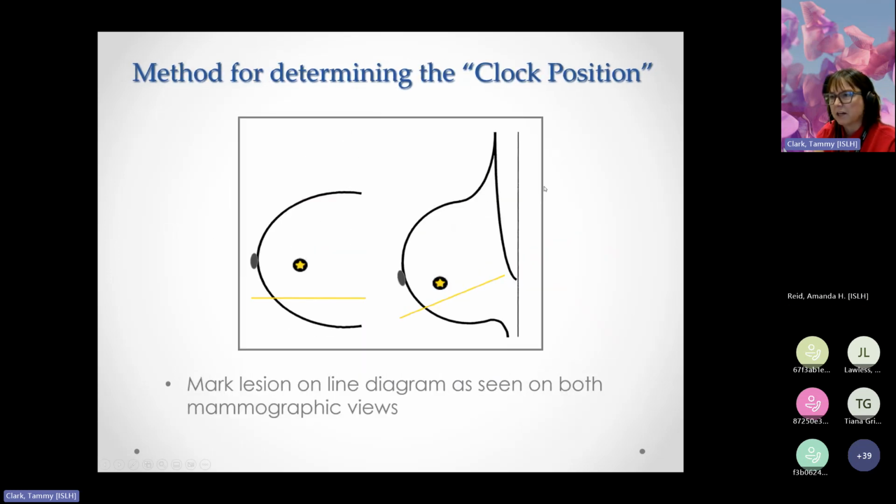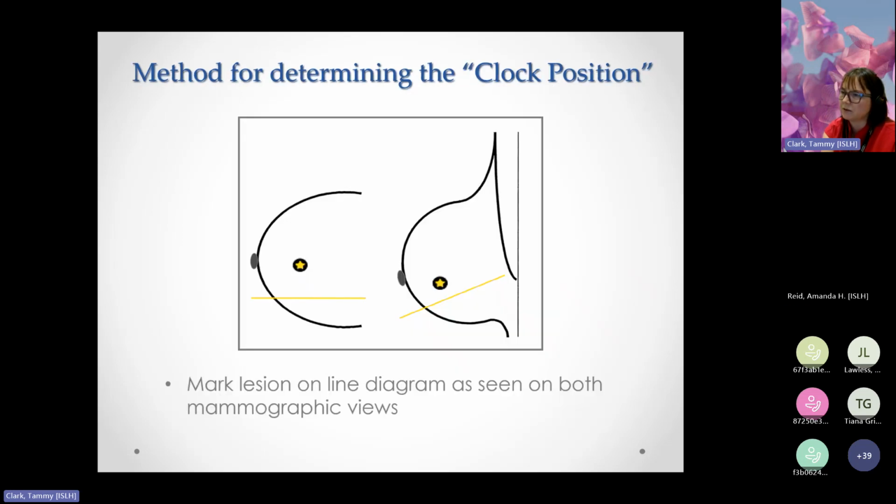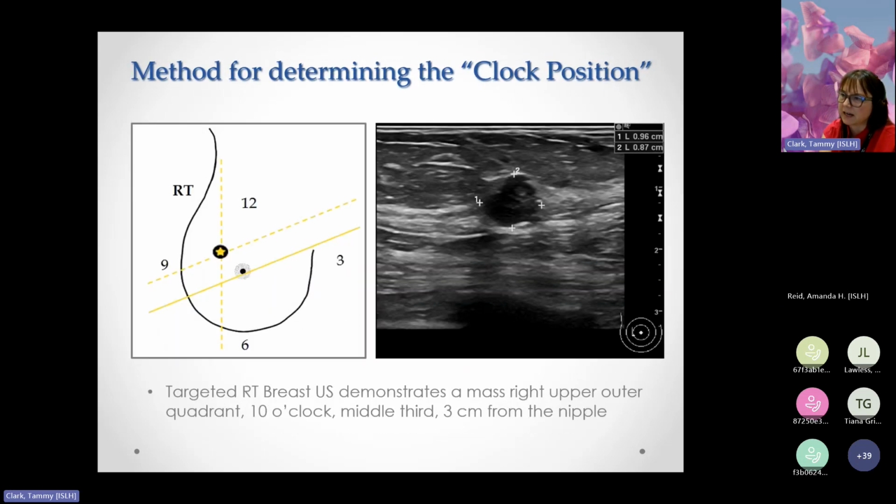Now, when we look at this patient's mammogram, she's not super dense. I would say this is a B density breast. So this patient would not have gone for preoperative breast MRI. So it's very important to make sure this is the only cancer that they have in this breast. They're not having that second check with the preoperative breast MRI, but they don't need it because the breast is about a B density. So we've done our job here by diagnosing this cancer.